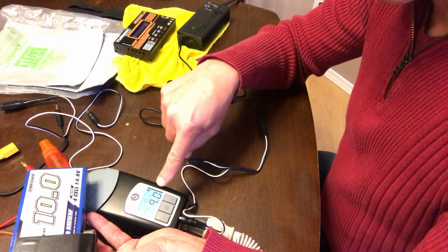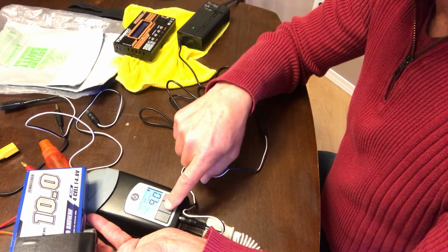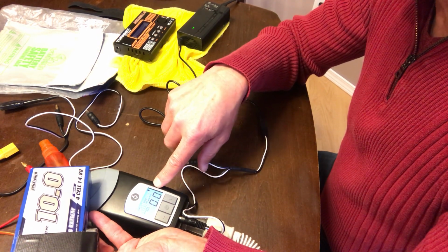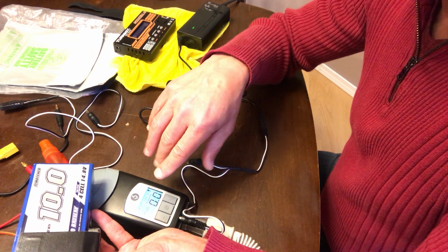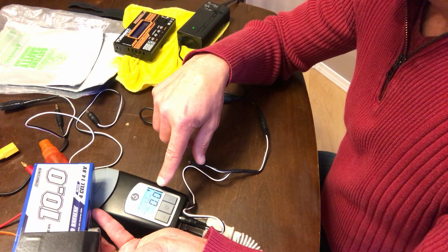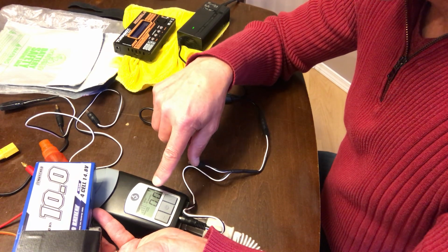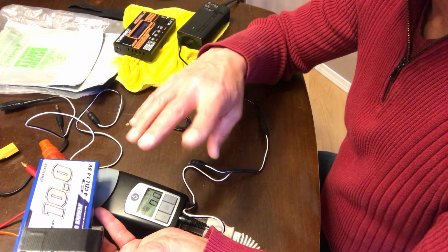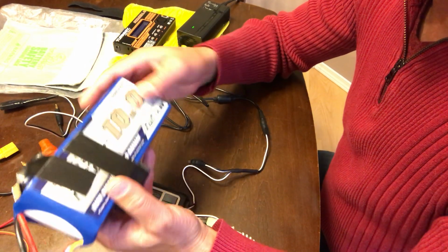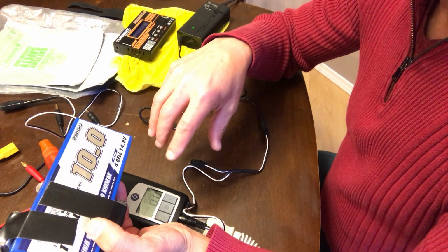So I've got mine set at 9 right now, and you might need more. I'm just a very light CPAP or sleep apnea, and so you might need more pressure than that. But at 9, I can get at least 4 days out of this and charging my iPhone. It's quite heavy. We'll weigh this whole system when we get done.